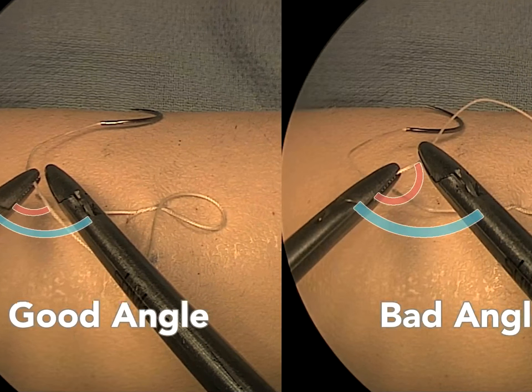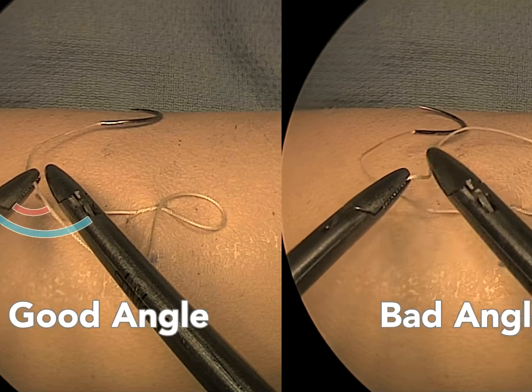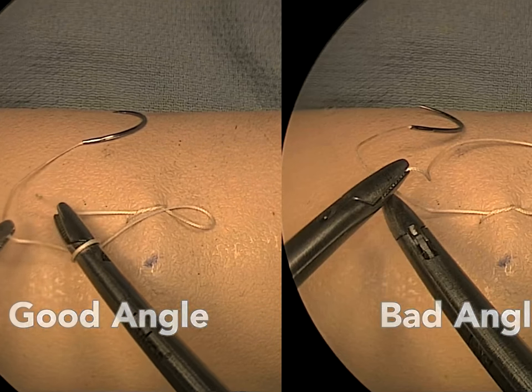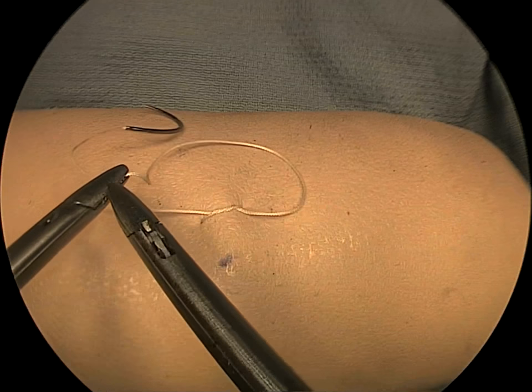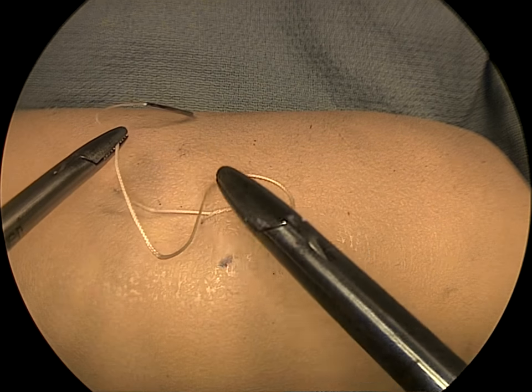In contrast, on the right, the suture angle is set much larger than the instrument angle, and a wind is unachievable. Resetting the suture angle to be equal to or less than the instrument angle provides the geometric relationship favorable for tying.